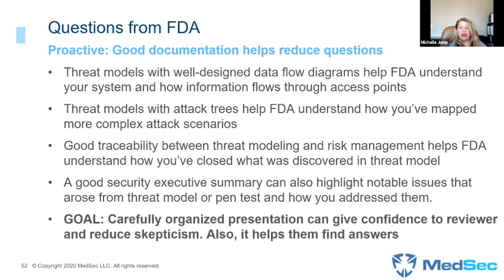So the overall goal is that a carefully organized presentation of your information can give confidence to the reviewer and reduce skepticism. It also helps them find their own answers if you're organized and structured, and it's clear that you've put good thought through the process, and also that you've been methodical in it.